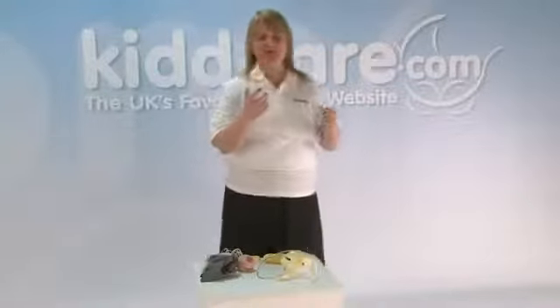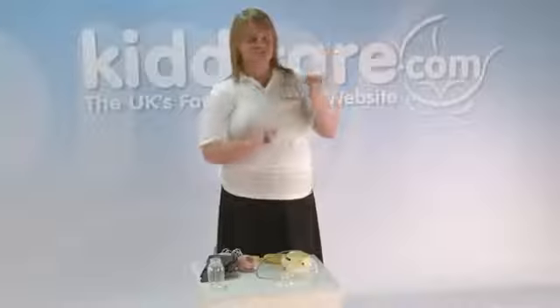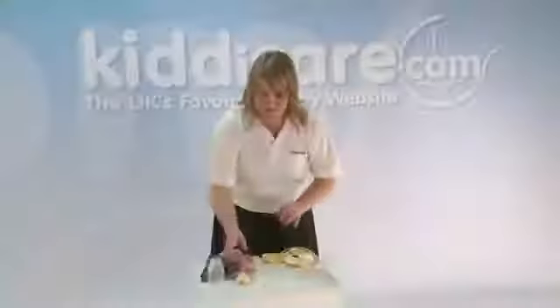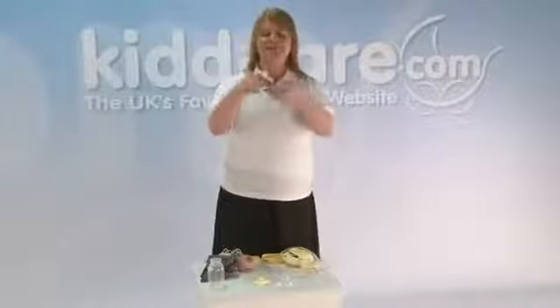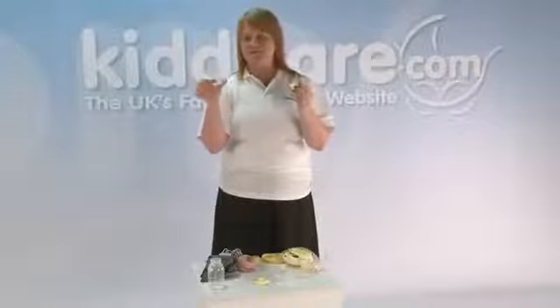To show you how it goes together, you've got the protective lid for the silicone. You unscrew the bottle, and then you have the Calmer top. You have 3 pieces here. So what you do, you pop it down, push on the white ring at the bottom, and then you remove the silicone. To take the silicone completely off the second part, you would just invert the silicone around the edge like that, and then hold under there and pull it off. So now you have the silicone on its own.